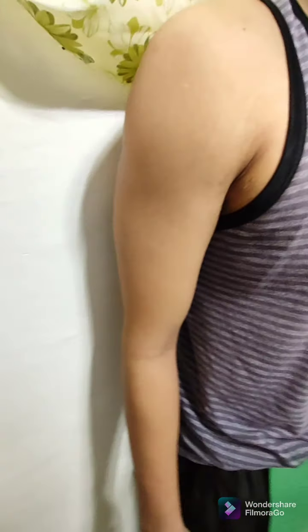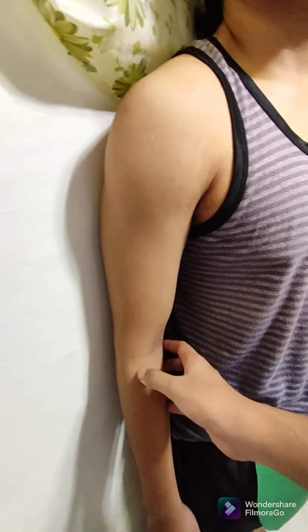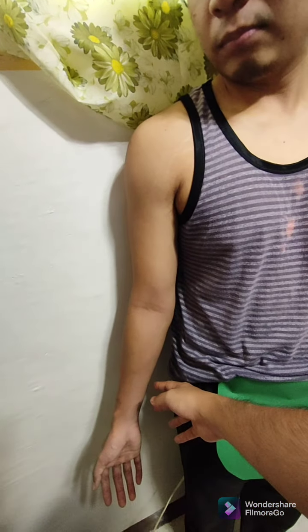So, make sure that the shoulder is in contact against the IR. Pwede natin pa-rotate minimally ang patient para makakomply dito. And so, ang first projection natin is ang AP external rotation. So, instruct natin ang patient to externally rotate the hand, so you can get an AP external rotation projection of the limb.